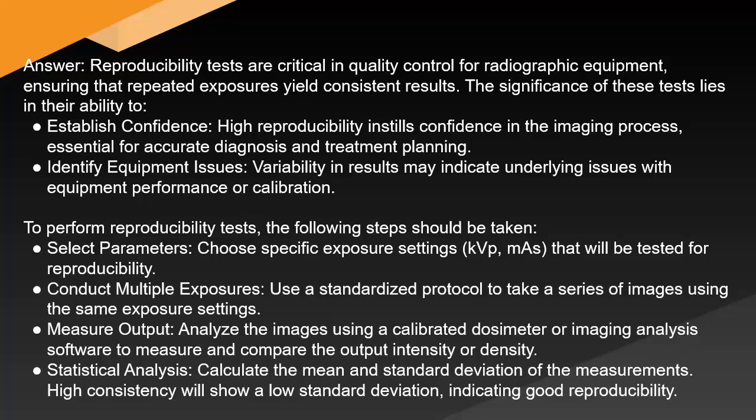The significance of these tests lies in their ability to establish confidence. High reproducibility instills confidence in the imaging process, essential for accurate diagnosis and treatment planning. Identify equipment issues: variability in results may indicate underlying issues with equipment performance or calibration. To perform reproducibility tests, the following steps should be taken.